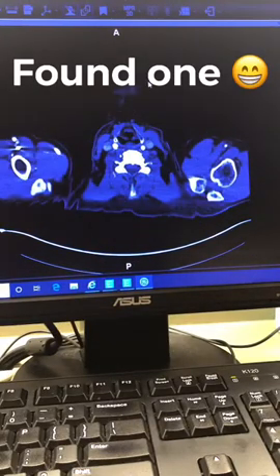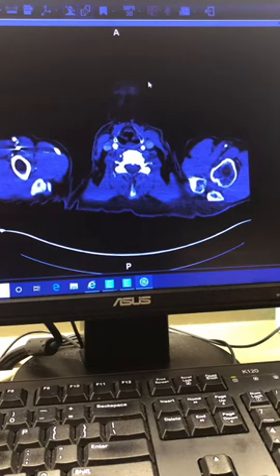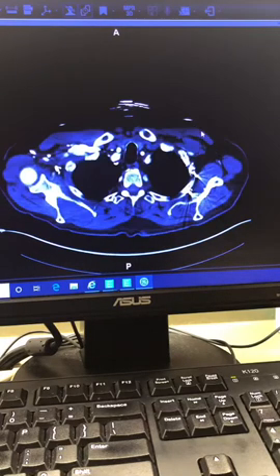All right, remember the way the protocol is set up, okay? We end up with a without chest, which is a regular chest, and then we do a with chest in the arterial phase, right? And the bolus tracking makes that specific. We do a 10-second countdown, and then there's our delay. Then there's our monitoring, and then it triggers at 100 Hounsfield units. There's another countdown, and then bam, we're in the arterial phase, and we scan.